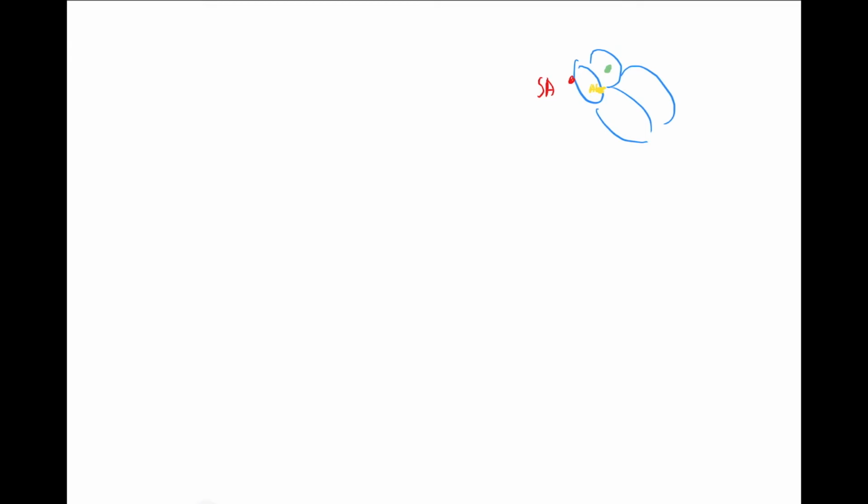But if this happens in the atria, you call it atrial extrasystole or supraventricular extrasystole. It's the same, it's a synonym. If this happens in the ventricles, you call it ventricular extrasystole. And I'll tell you 3 major points you have to know to tell the difference between an atrial extrasystole and a ventricular one. So now we're heading to atrial extrasystole.